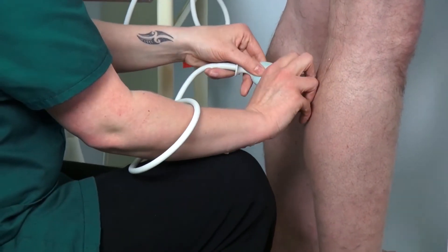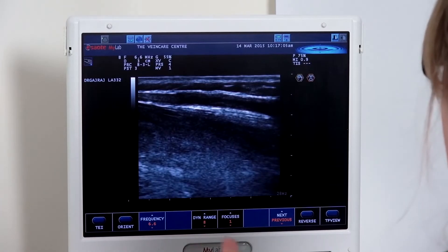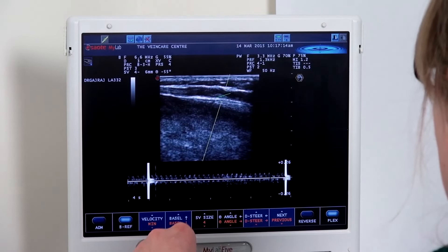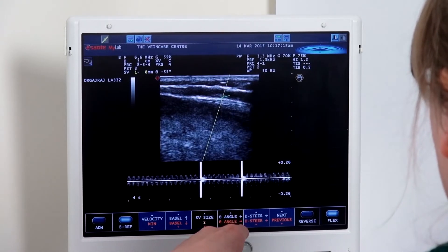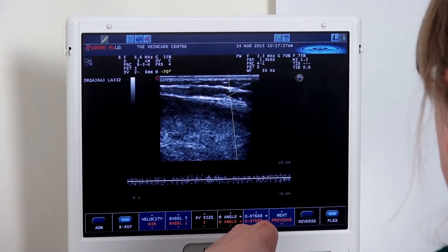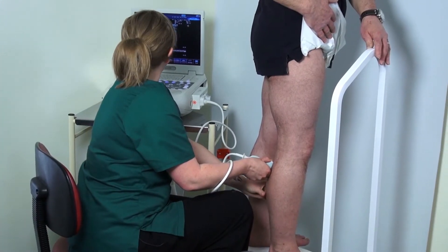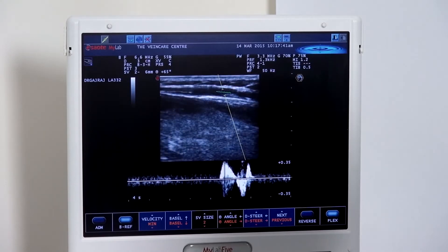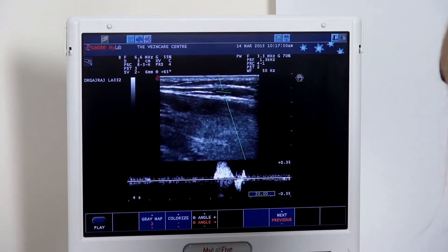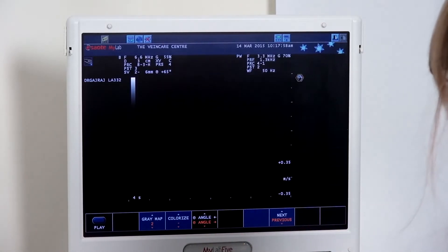The short saphenous vein looks nice and normal in calibre. We can check the competency, obtaining the short saphenous vein in a nice longitudinal section. This vessel is a bit smaller, so our sample volume is too great — we need to reduce the size of the sample volume box to make it more accurate. We also need to angle to the vessel walls. Following a good squeeze, we can see nice cessation of flow and a competent short saphenous vein.